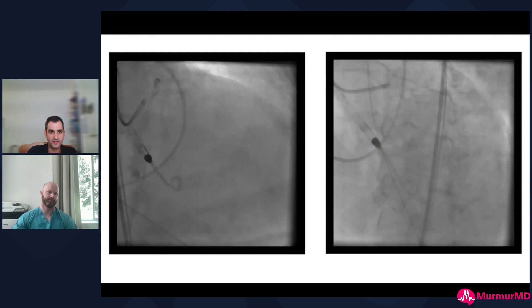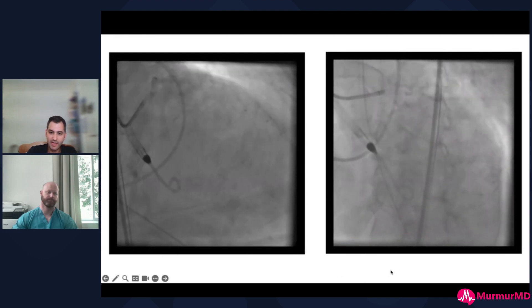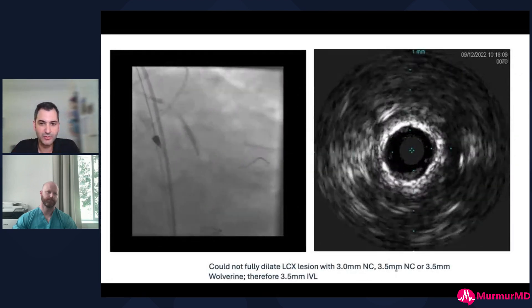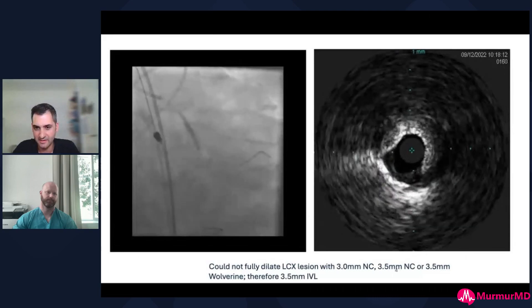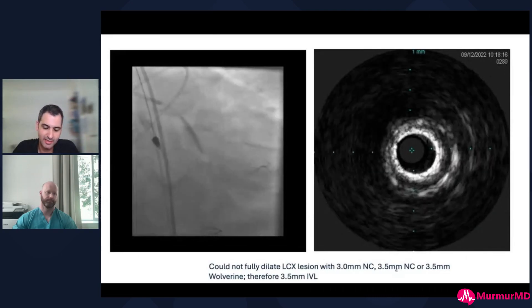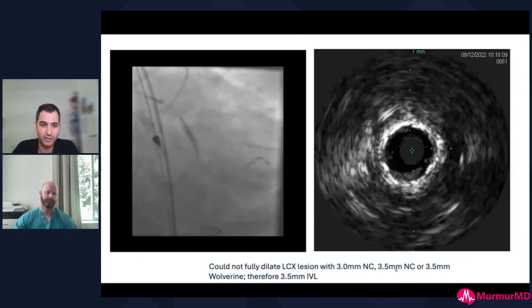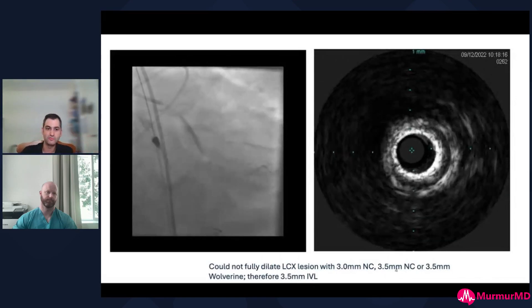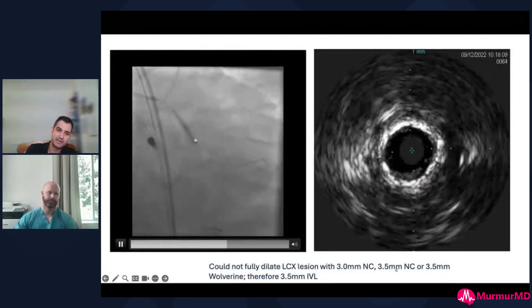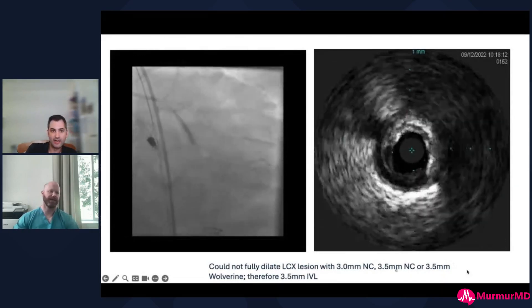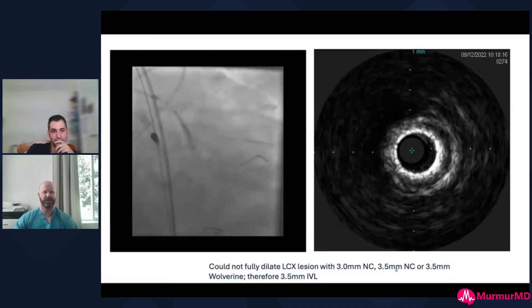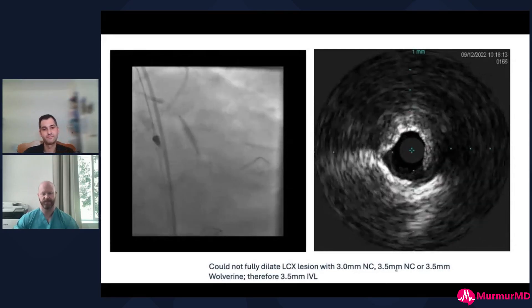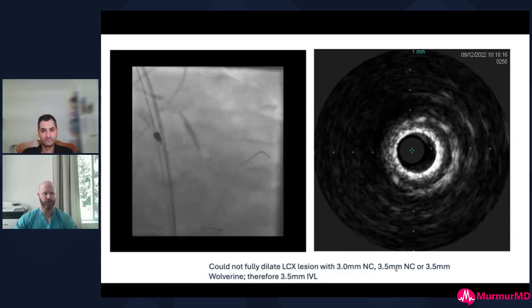For her, we exchanged out the balloon pump same side, single access technique, and put in a 7 French guide. We started working on the circumflex first — plan was to leave the right for another day. This was before high-definition IVUS, but you can see very severe calcium throughout the circumflex. We tried to dilate with pretty large non-compliant balloons and cutting balloons. With calcified lesions, I tend to take a longer non-compliant balloon so you can really see the areas of under-expansion — it was clearly under-expanded pretty badly in a couple of spots.